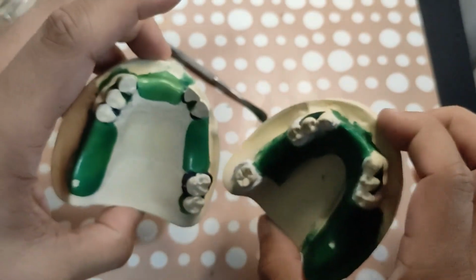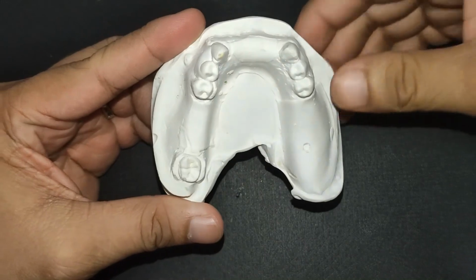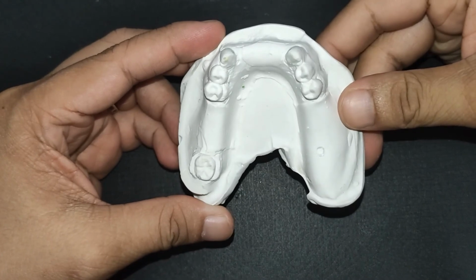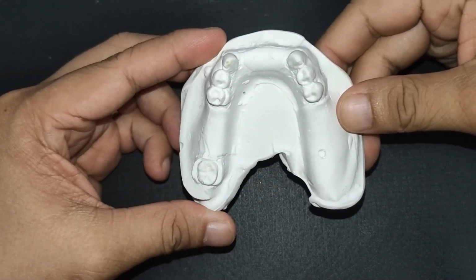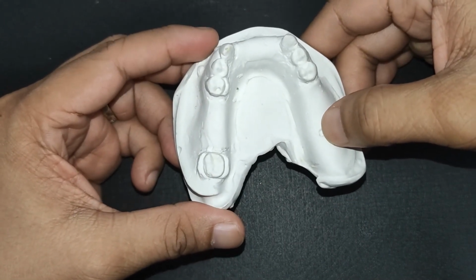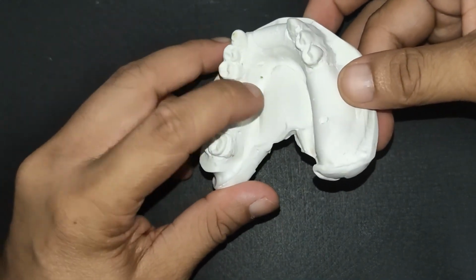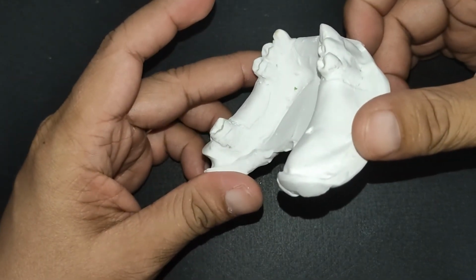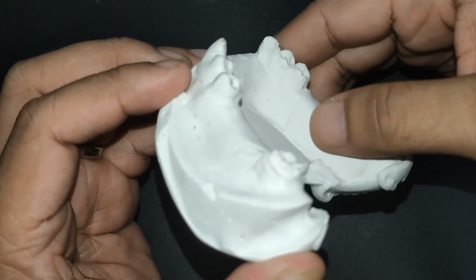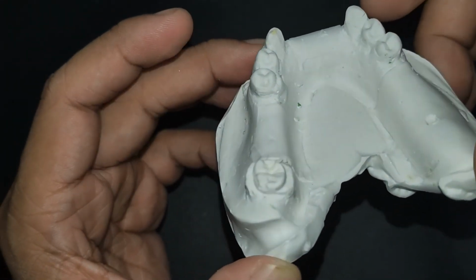Okay, so next thing I'll show you is the refractory cast. Alright, so this is the refractory cast after I've taken impression of the master cast with the cast preparations. Notice the tissue stop is still visible, the blockouts are there, there's another blockout there, the finish lines are distinct, finish lines are again, it's here, you can see it. Okay, alright, so that's the lower.